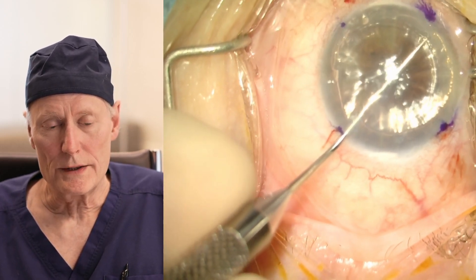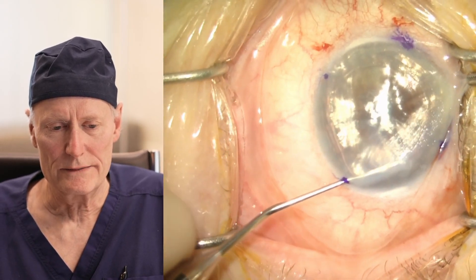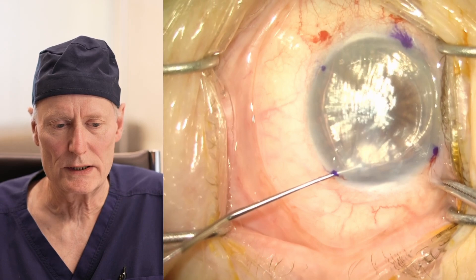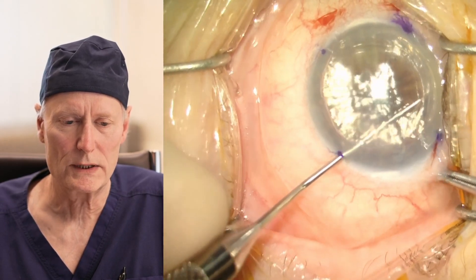Essentially, all that we're doing right here is just tracing an outline of the diameter of the transplant that we'd like to use — or actually just a little bit bigger than the diameter of the transplant that we'd like to use.